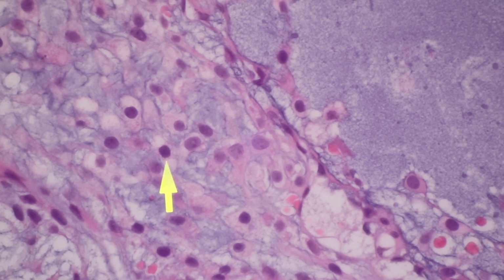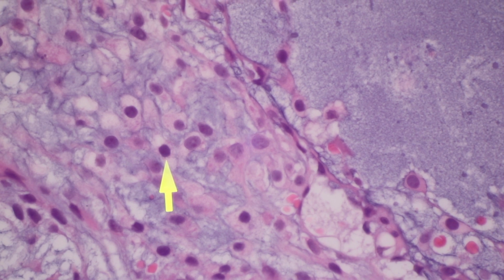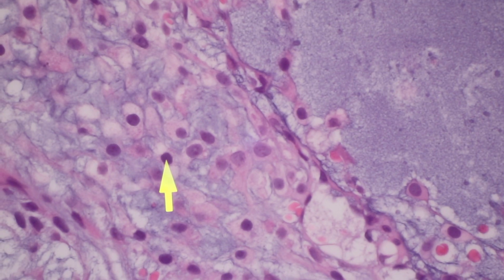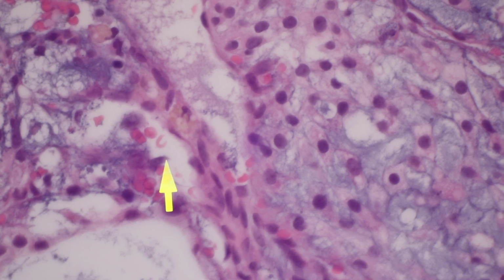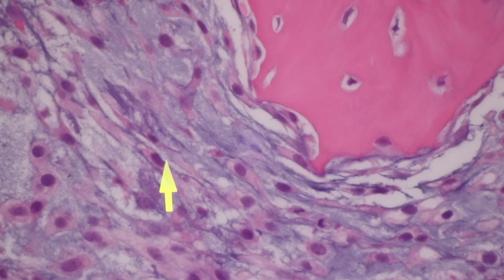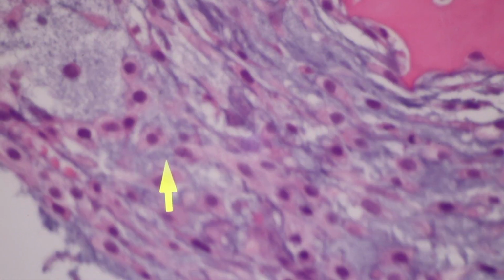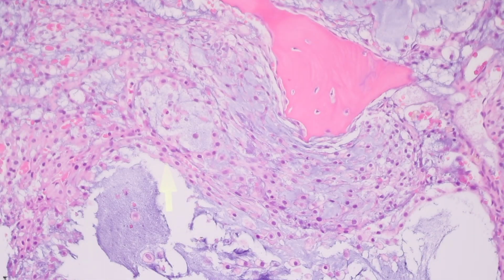This nucleus is more hyperchromatic, but notice it's big. It's much bigger than the nuclei of a normal chondrocyte. So it doesn't have an irregular contour, but it's big and dark, and that's what I expect to see in a grade 2 chondrosarcoma.